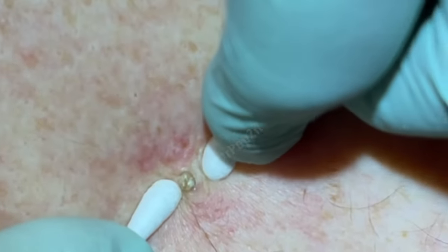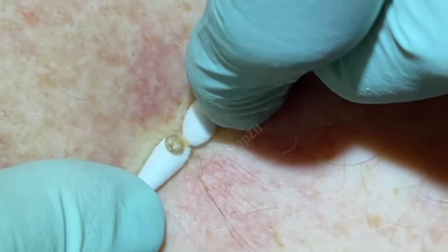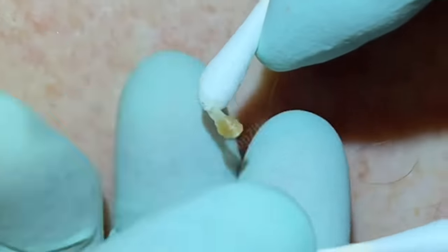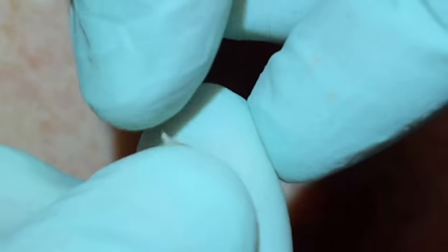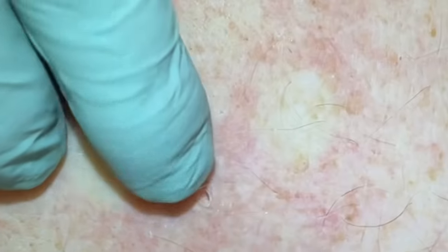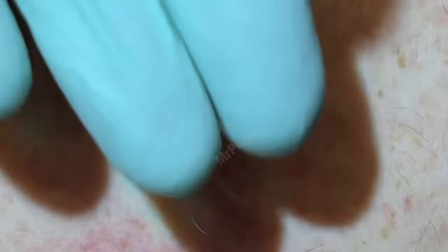Deep pressure there — get that plug to come right out — there it is! You can see it's kind of pasty at the bottom, more moist, and that oxidization on the top. Empty pore — totally empty — went pretty deep on that one. Once we get those contents out, sometimes they'll tighten up a little bit so they're not as deep.